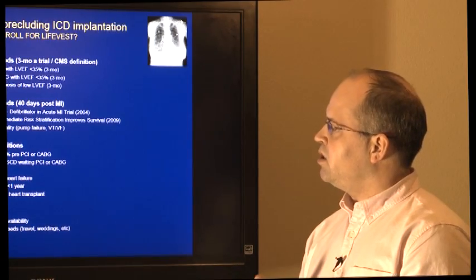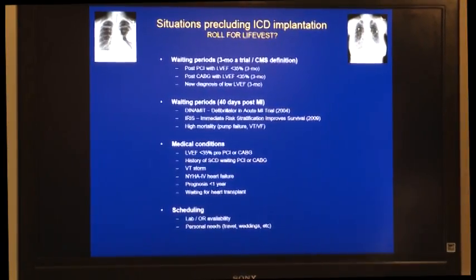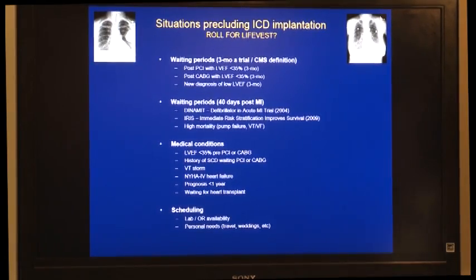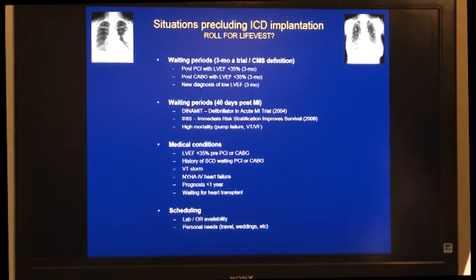And then other medical conditions. So you can have a depressed ejection fraction, you're awaiting your revascularization or your CABG, you have to wait for whatever reason. There's another illness perhaps, they want to medically optimize you. You can, even in hospital, have the wearable cardioverter defibrillator on to protect you in that high-risk waiting period. Again, history of sudden cardiac death when you're awaiting PCI or CABG, so you've had the arrhythmia, you already meet indications, but we're planning a major procedure for you, so it's prudent to wait till after that to do your implant, so why not protect upstream while you're in fact waiting for that event.